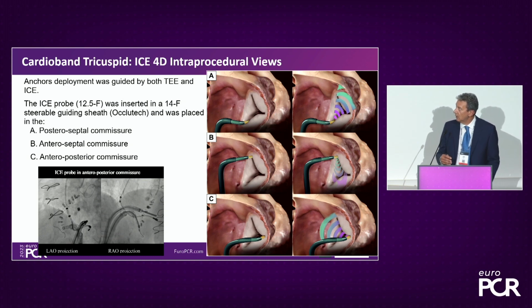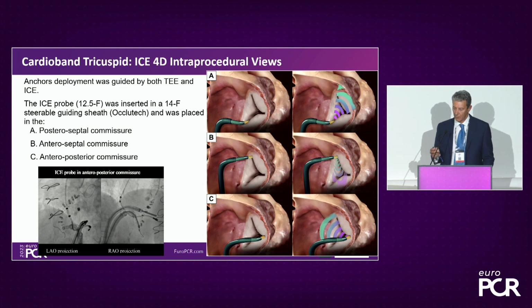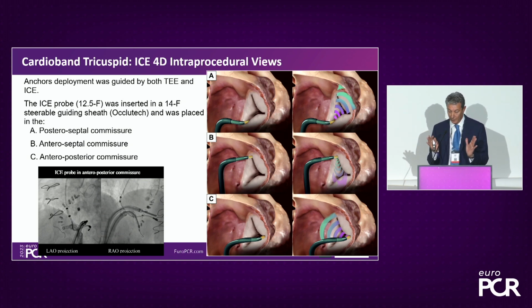Then you move anterior all the system, and keeping the long sheath in position, you rotate the probe 180 degrees, and you have an excellent visualization of the posteroseptal and lateral view, and the septal is well visualized moving in lateral position between the anterior posterior commissure, and usually you have a good visualization of the annulus. You don't need to move from transgastric to the transesophageal position, and the main advantage is that to place the probe, you acquire the volume, and then electronically you scan all the annulus.